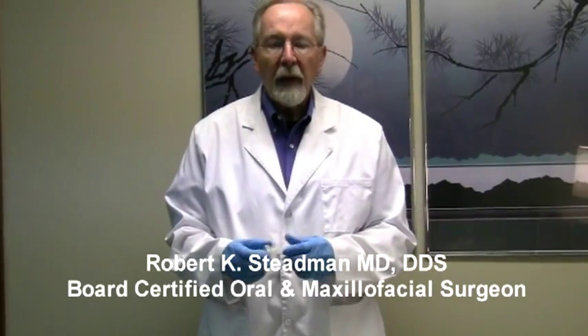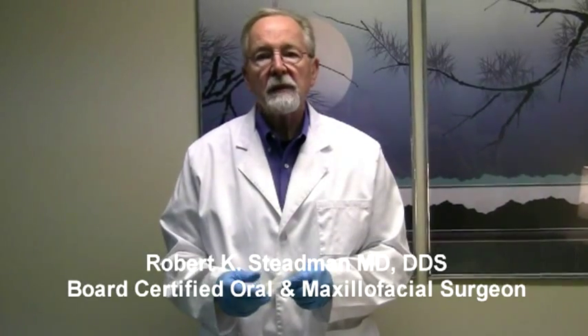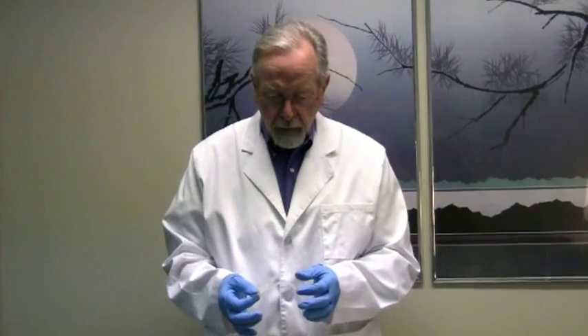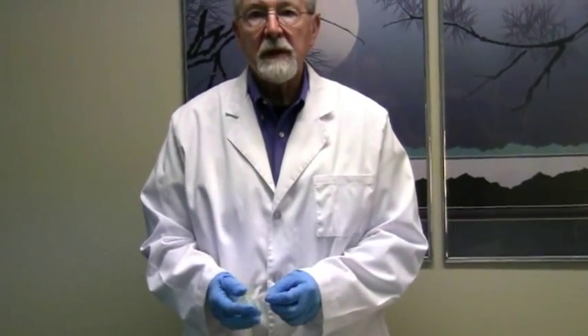The New Zone Medical Dual Air Oropharyngeal Airway has been a real bonus to outpatient general anesthesia procedures. We're able to use this adjustable airway in conjunction with the bite block and oropharyngeal screen that we typically place for oral maxillofacial surgery procedures.